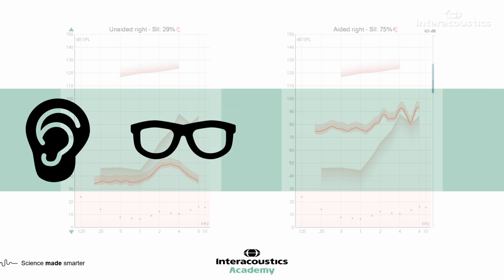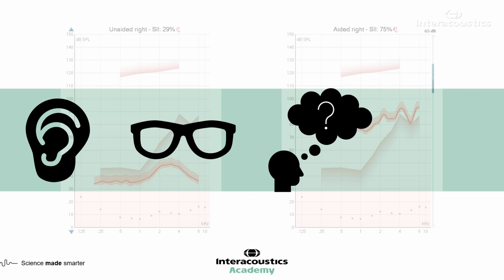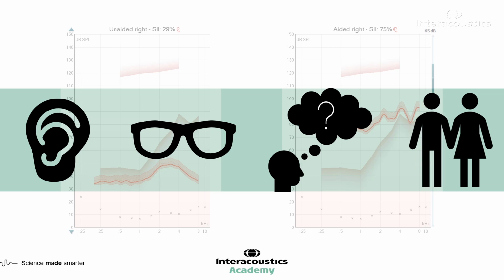This multisensory approach to counselling is highly beneficial in supporting patient recall, which is known to be poor across all age groups, but can be additionally challenging for the elderly population. This visual display of the hearing aid function is a great tool for engaging the patient's significant other or support person. Not only does their involvement further assist with patient recall, but this also supports the provision of family-centered care.